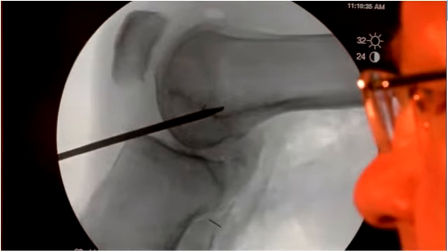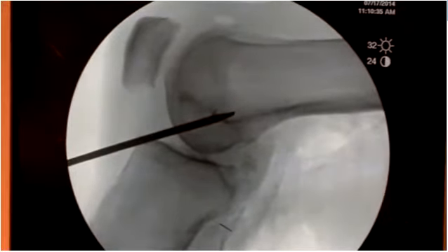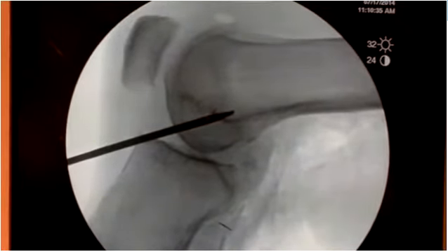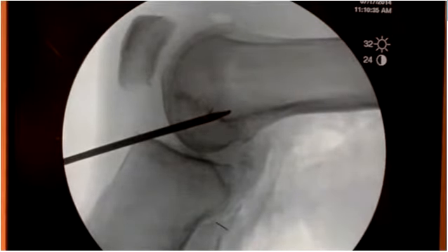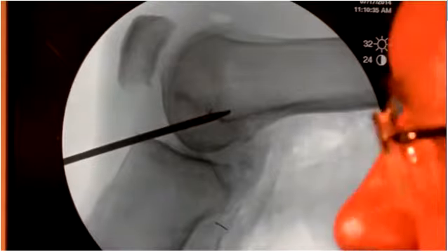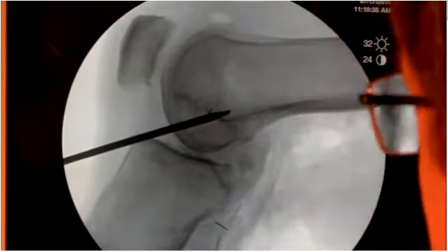It's usually pretty consistent. I mean, that's the axis of rotation and the center of the MPFL. So you may have to move it a millimeter or two, but usually not much. So that's something you can do very easily during surgery. You fix it on the patella first, and then you check it afterwards.